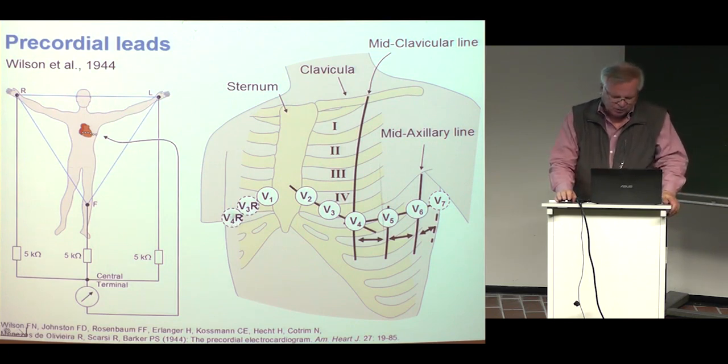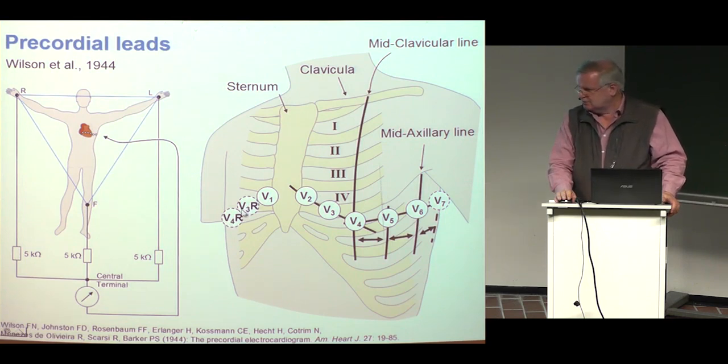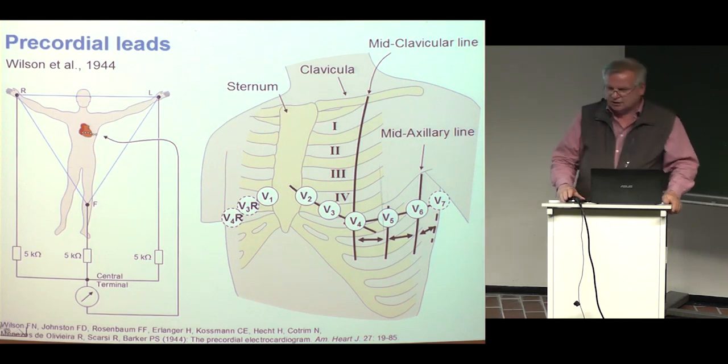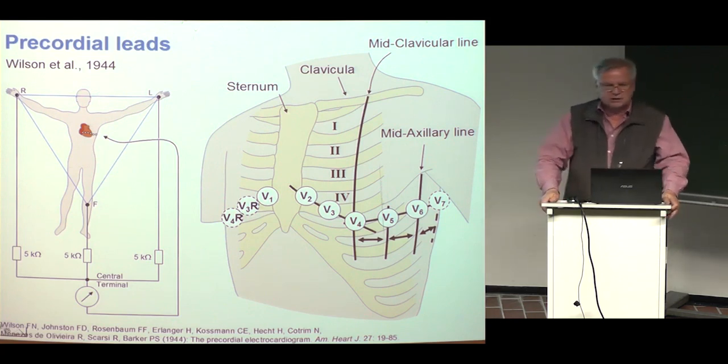Recording points which are symmetrically on the right side of the chest may also be used. When these right side recording points are used, there is one important application where they are used. Do you know? It is called a case of dextrocardia. I don't have a number, I should find a number.